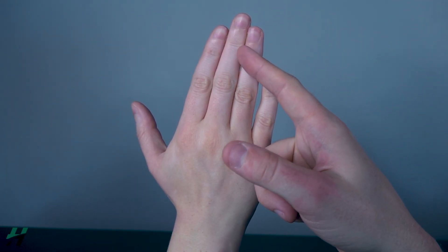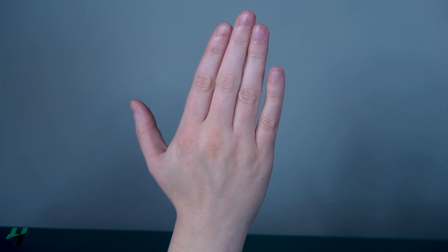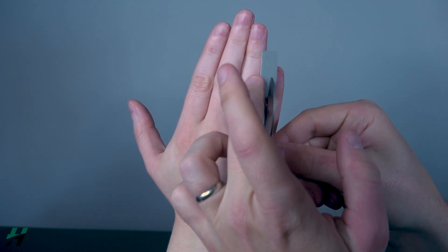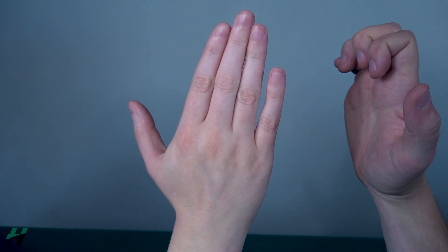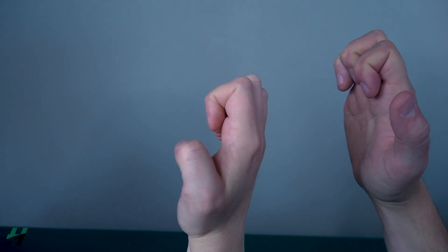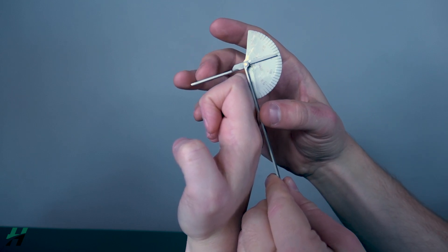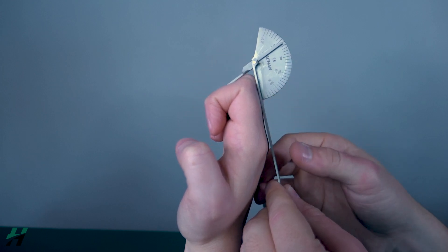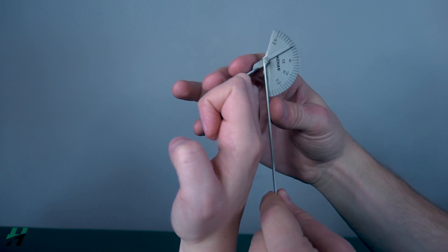Measuring PIP and DIP flexion: the patient will be in a seated or comfortable position. The measuring process for both joints is similar so we'll cover them together. To measure, you want your stationary arm on the proximal phalanx and your movement arm on the middle phalanx, with your axis on the PIP joint. Rachel, curl your fingers into a bear claw and hold it. Right here we're looking at 120 degrees, and you do this same process for each of the PIP joints.